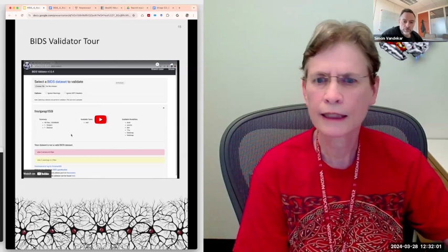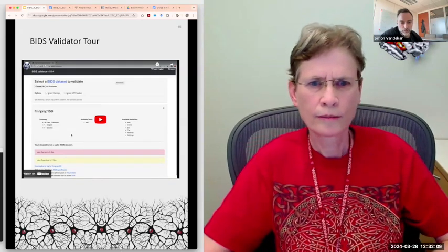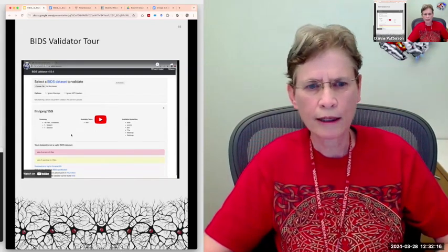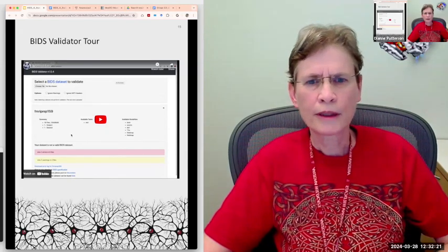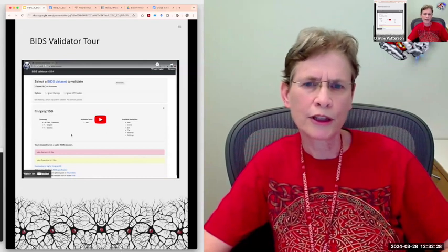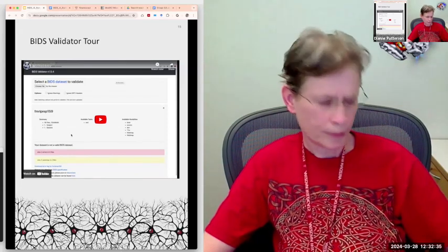Diane, yes. If you have ASL data that doesn't fit into one of those imaging categories, where do you put that? ASL data does now fit. You put it in a directory called perf, P-E-R-F, perfusion. And there are some extra hurdles with it because not all the information is easily available and extractable from the DICOM. So sometimes you need to add some information. So ASL is still a bit of a special case, but there is a BIDS standard for it. Cool. Thank you.